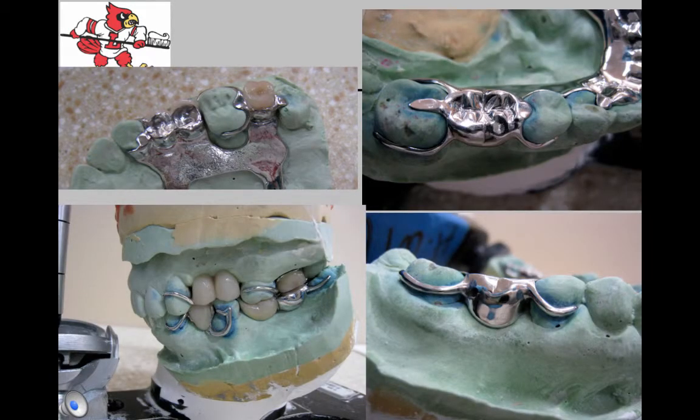Here is a side view of the different teeth. Now I'm not really happy with teeth number 12 and 13. Look at their occlusal length compared to 11 and 14. They're too short. One of the reasons to use a facing is that the buccal occlusal surface can be left long because it has a metal backing behind the buccal cusp if a deep bite exists.